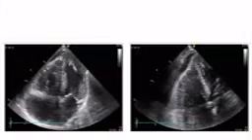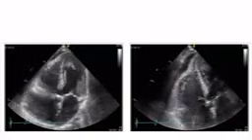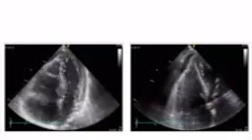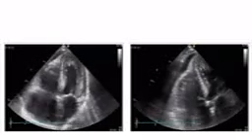Here we have all the typical findings. The elevated pressure that the patient has to pump against now led to a dilatation of the right ventricle and to poor right ventricular function. So you can see echocardiography can help us diagnose pathologies if we understand how the ventricle reacts to such situations. Let's go to the next example.